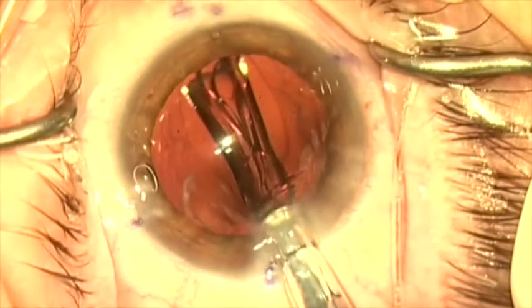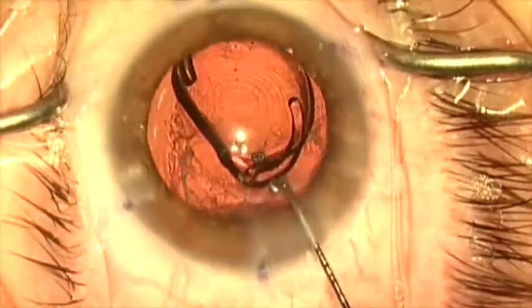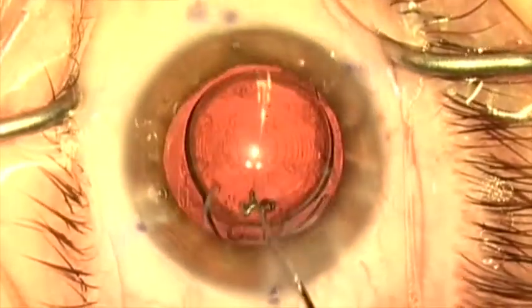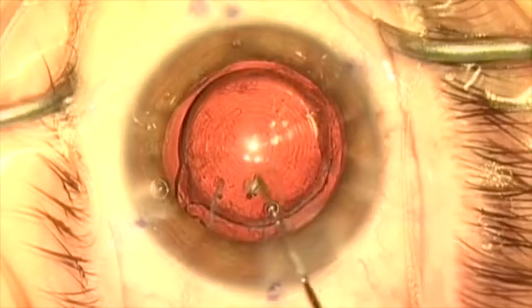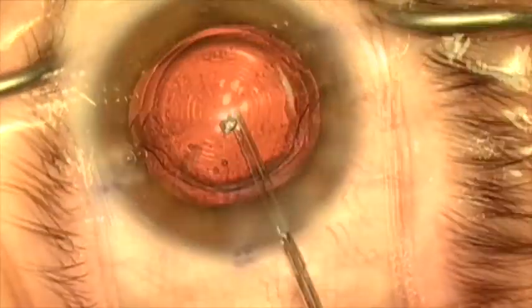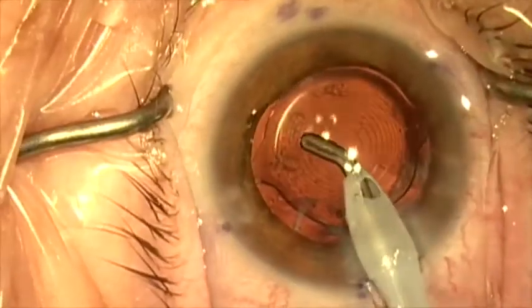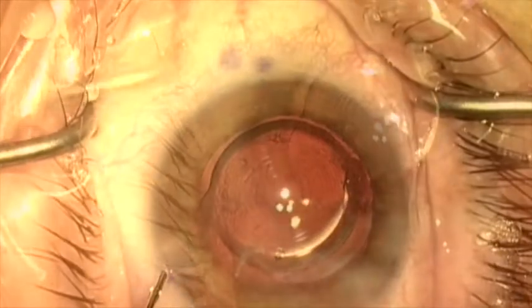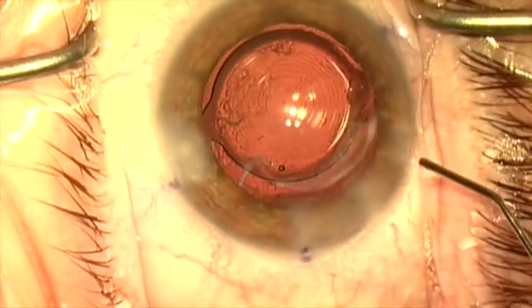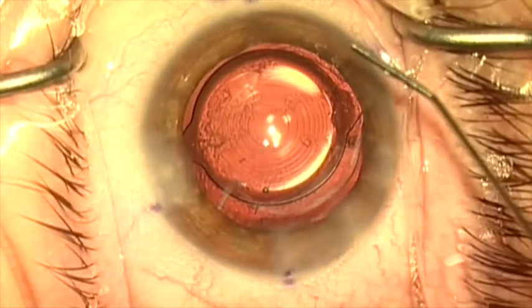I'm now going to put the new lens — a Symfony Toric lens — in, inject it into the capsule bag, and rotate it into the proper position that I marked at the beginning of the case. The lens rotates freely and opens up freely because there's no remaining fibrosis in the bag to prevent it. After rotating the lens to the proper axis to correct astigmatism, the residual viscoelastic is removed from in front and behind the lens. The wounds are stromally hydrated to secure them, tested, the pressure increased to physiologic, and the case is completed. Thank you for your attention.